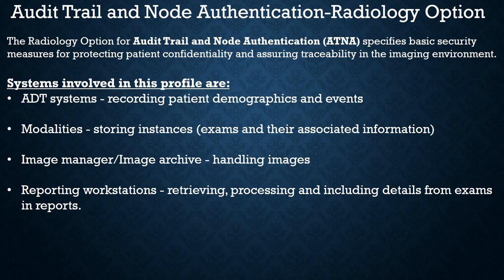Audit trail and node authentication. ATNA, one of my favorite profiles, and perhaps my favorite infrastructure profile. The radiology option for audit trail and node authentication specifies basic security measures for protecting patient confidentiality and ensuring traceability in the imaging environment. Systems involved in this profile are the ADT systems, the modalities, the image manager and image archive, and the reporting workstations.